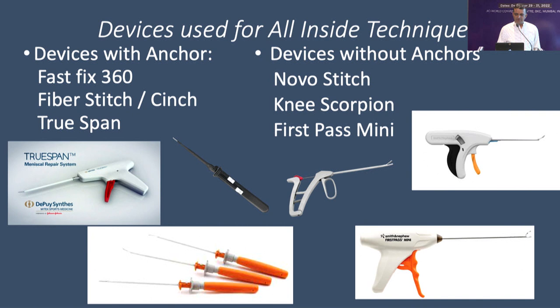The devices used in all-inside techniques are different. We can classify them as with anchor and without anchor. With anchor, there are many companies with different guns, and you should be familiar with that mechanism outside before starting the procedure. And of course, you have to consider all these points and have good anatomy of the posterior part.